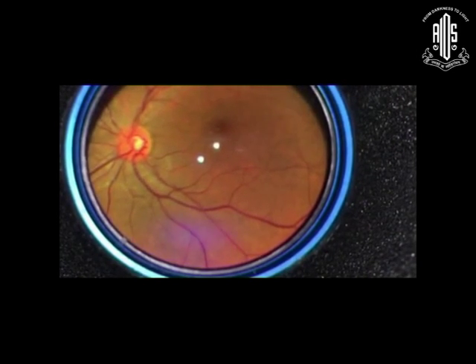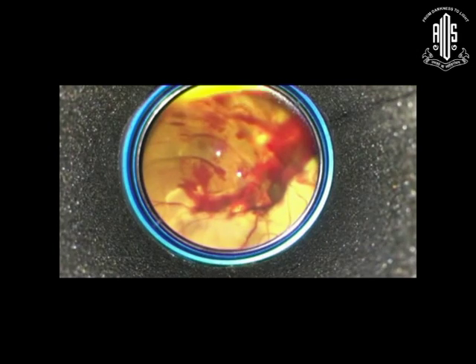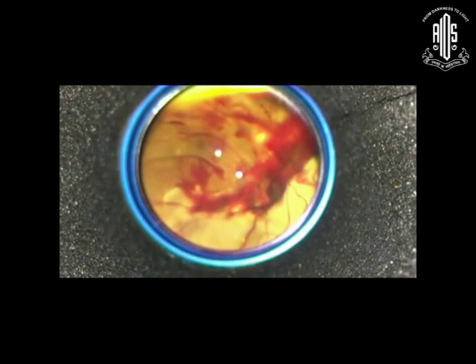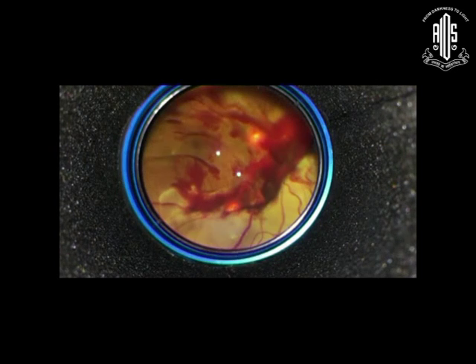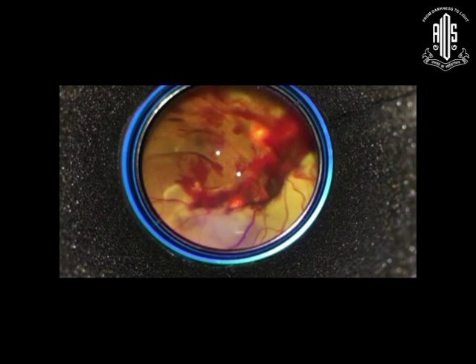And there is a manual focusing mode in one of the apps called Camera Plus, and you can see that being demonstrated here. Focusing is done manually, and you get a good quality picture. You can see the vitreous hemorrhage when the eye moves. You can see the dynamic changes that happen in the eye.